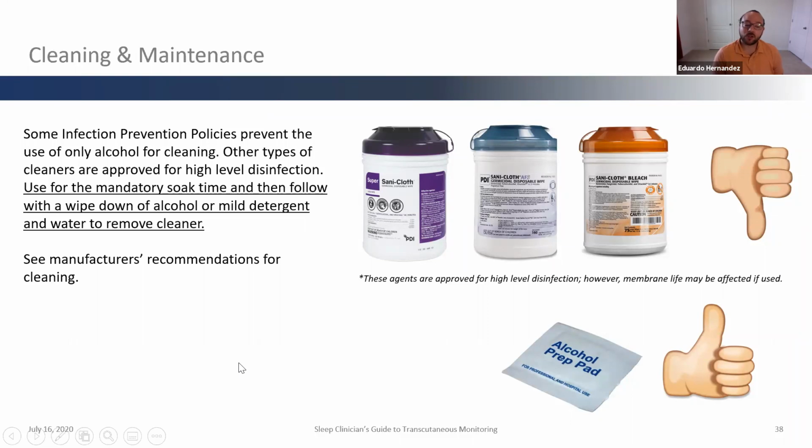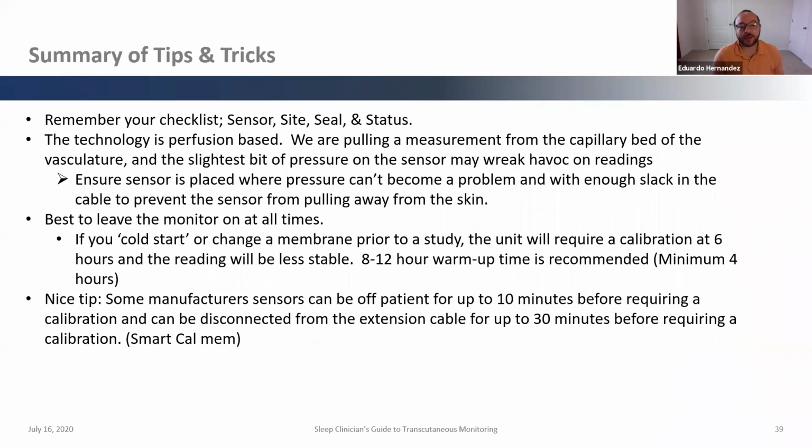And that also goes with the manufacturer's recommendations for cleaning, that you use some kind of a cleaning agent. In our hospital, we use alcohol prep pads. If for some reason we needed something stronger based off of patient's conditions, we might use something stronger, but we would also wipe whatever that is, because that'll still stay on the surfaces, with an alcohol prep pad as well. So, in that sense, it's important to keep the health of your patients, the health of your staff, everyone as healthy as possible.